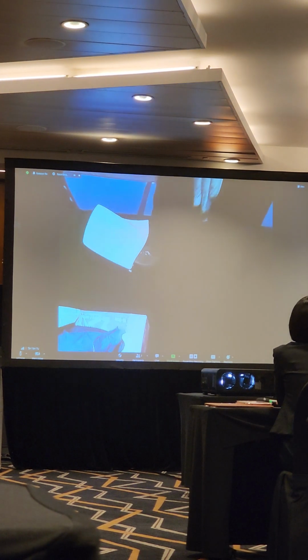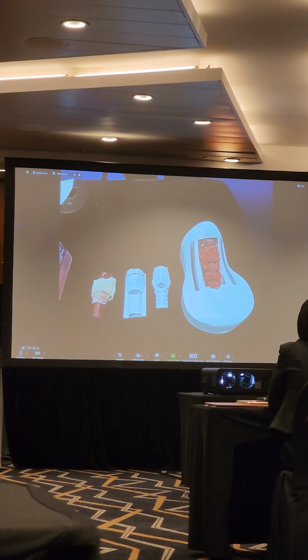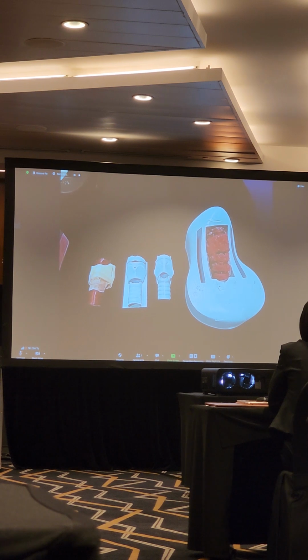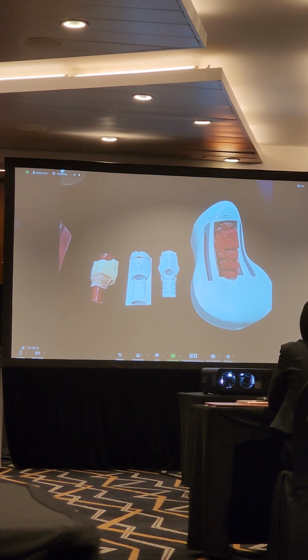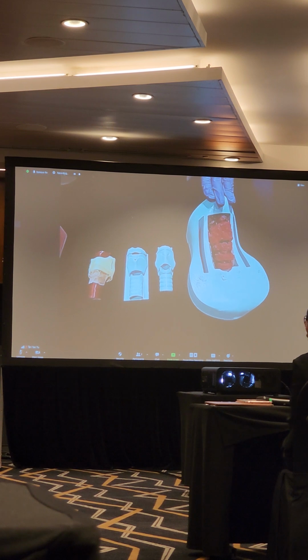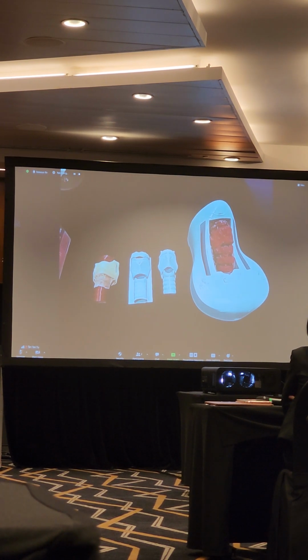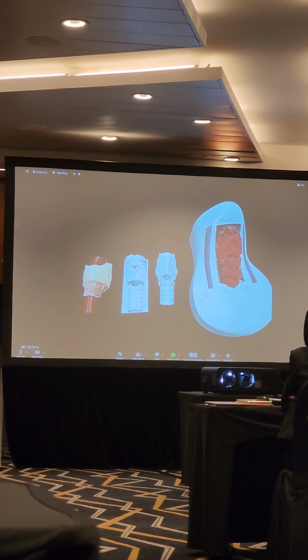There are other models that we have, and I'd like to make a key note here: number one, the basis of all these models are open access. We do not own the models, we did not come up with them. They're all done by very brilliant people, and they'll all be posted online, so they're free to download. You can just load them onto a 3D printer. Any grade is fine. This has been printed with a hobby grade 3D printer that's commercially available and that you can just buy online, all the way to more advanced 3D printers that can achieve quite good results, as the one that we're using over here.